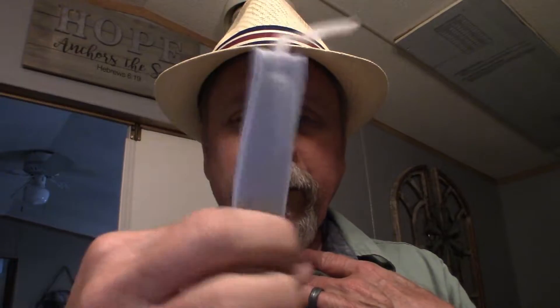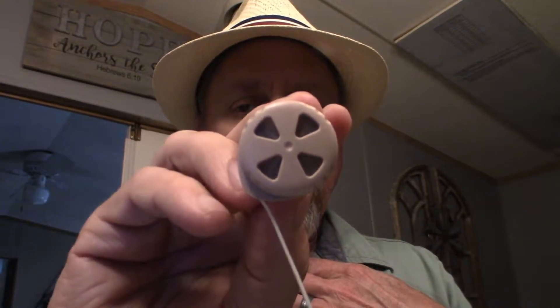The actual changing. I have found that it's easiest to go ahead and remove the strap. Those straps are cheap — they have Velcro on them and they latch on. I always change them because they get sweaty. So every time I change my trach, I change the strap as well. Now I am only holding this in by my hands. What I'm going to have to do next is take off my speaking valve. It just pulls off. And I have to have my finger over the hole now in order for me to talk — if I take my finger off, I won't be able to talk very well.